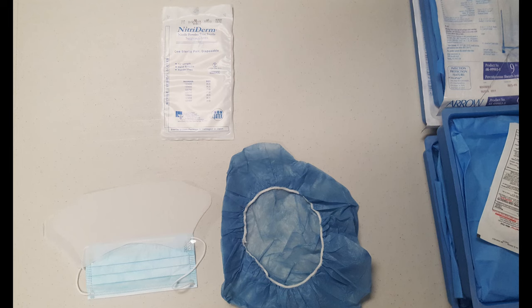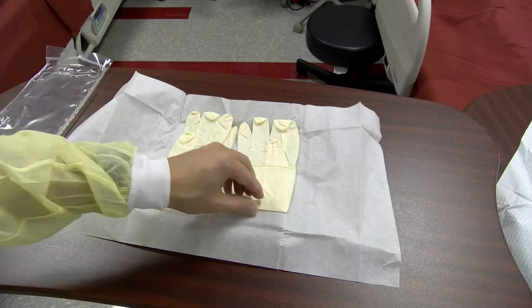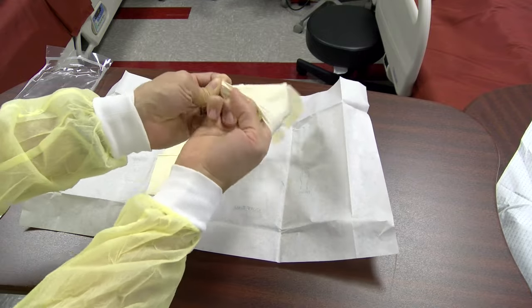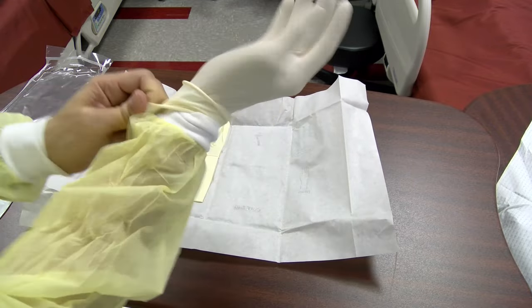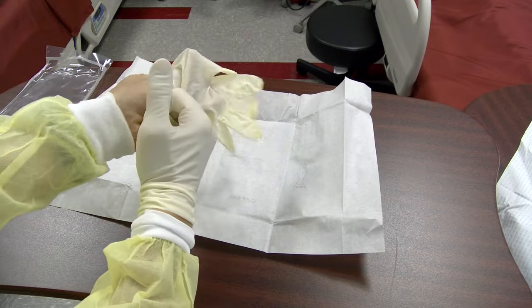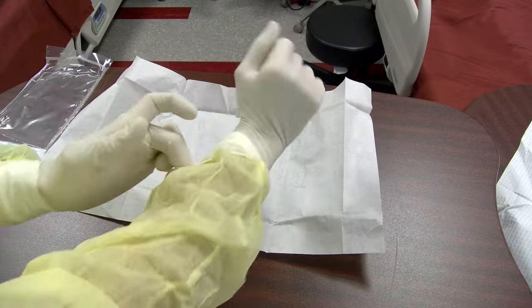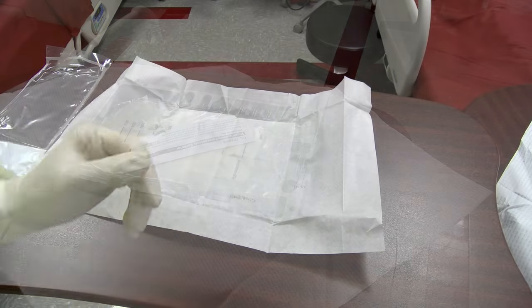Sterile gloves and a face shield should be worn for this procedure. Be sure to have the patient positioned supine with the area for insertion exposed prior to donning sterile equipment. In the absence of an overt bleeding disorder, routine evaluation of platelets and INR are not required, even in patients with cirrhosis.